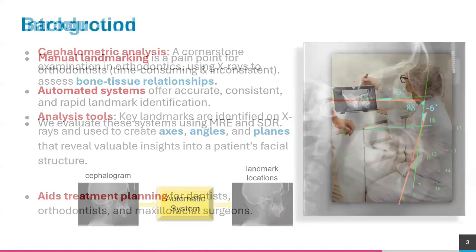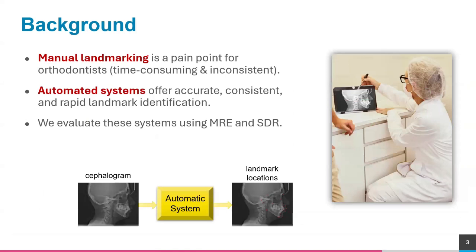However, marking these landmarks and finding these measurements is a tedious and time-consuming process for the orthodontists. Also, it is prone to high intra-observer and inter-observer variability. Therefore, there is a need to develop an automatic system that can identify these landmarks accurately, consistently, and rapidly.